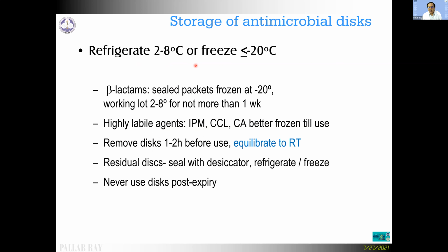How do you store antimicrobial discs? You know that antimicrobial discs should be refrigerated at 2 to 8 degrees centigrade for short term, or frozen at -20 degrees or less for long term. Beta lactams are particularly labile. There are highly labile agents like imipenem, cefaclor, and clavulanic acid, which should be kept frozen until use.